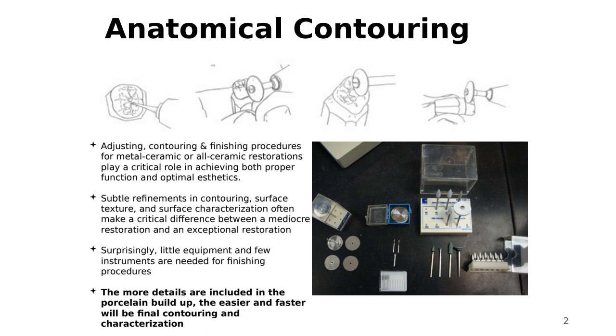Some people are a little bit older, or have bruxism, they grind the teeth down. Their anatomy is almost gone. So if we have to copy what the patient has, we're looking at the anatomy and we copy that.